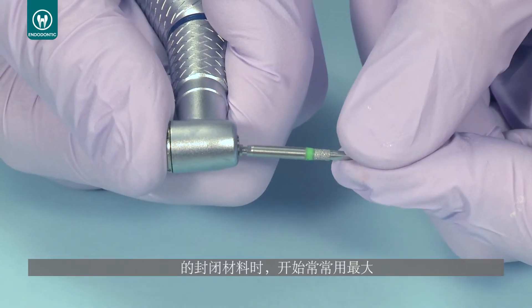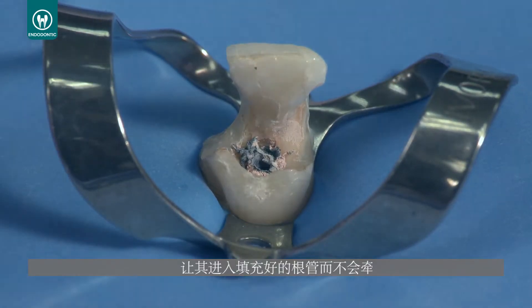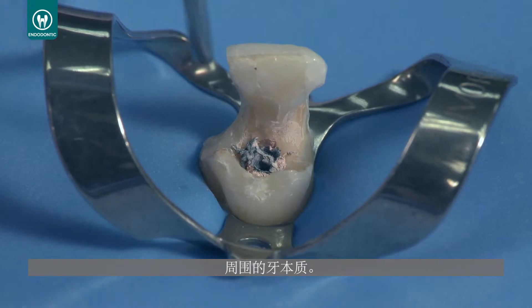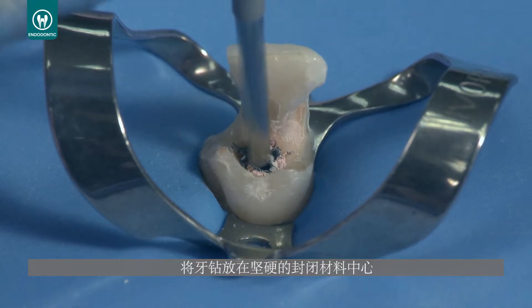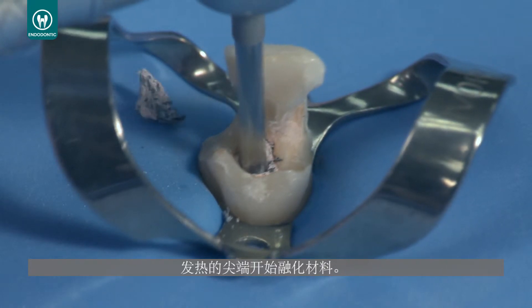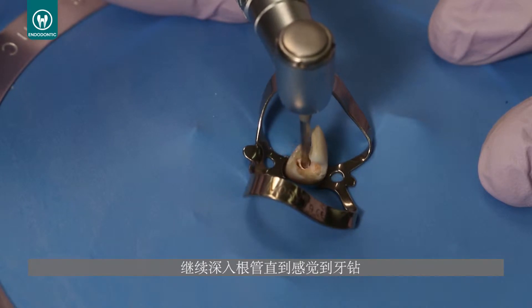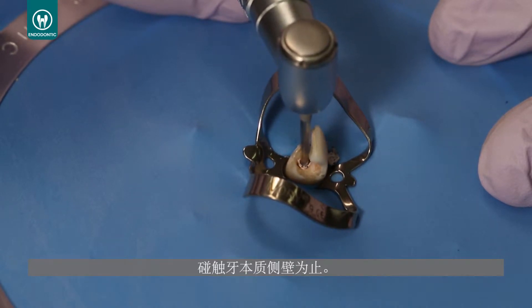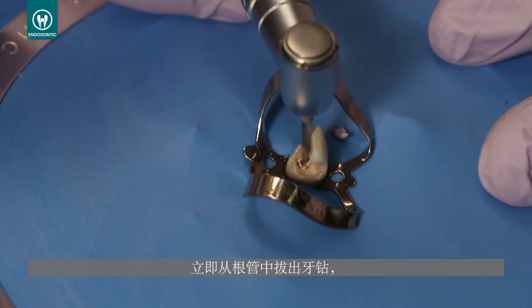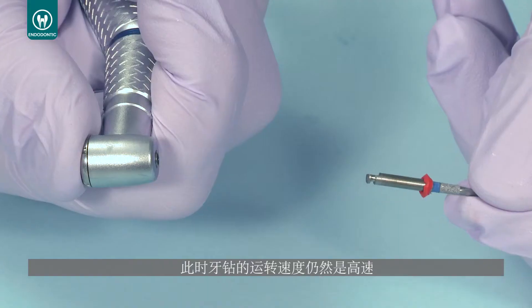When working with rigid carriers, always start with the largest Unicore drill that will enter the filled canal without engaging any peripheral dentin. Place the drill in the center of the rigid carrier and run the drill at 20,000 RPMs. After a few seconds, the heat generating tip will begin to melt the carrier. Proceed down the canal until you feel the drill engage the dentin sidewalls, then immediately remove the drill from the canal while still running at a high RPM.